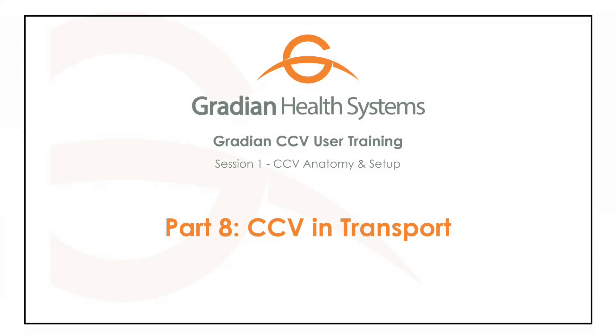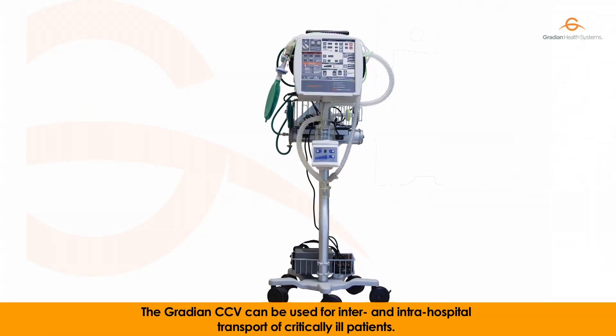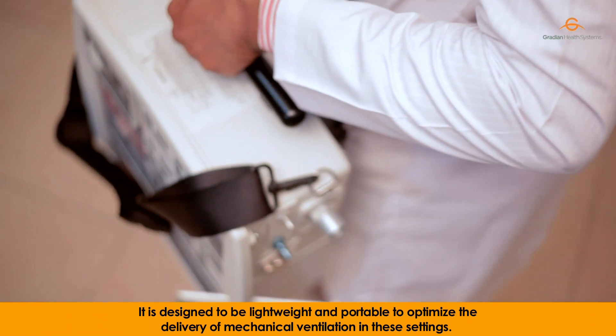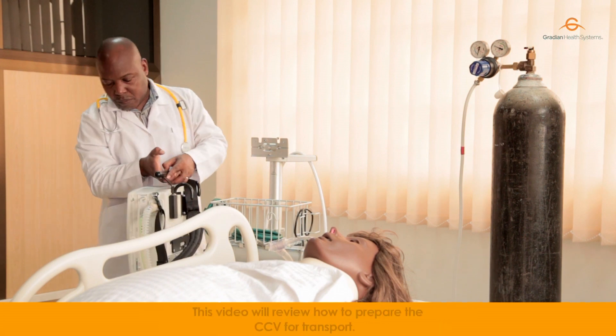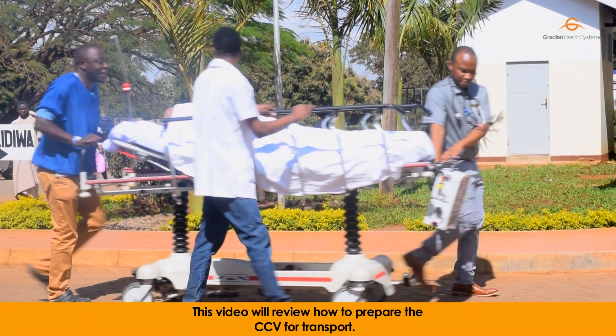The Gradient CCV can be used for inter- and intra-hospital transport of critically ill patients. It is designed to be lightweight and portable to optimize the delivery of mechanical ventilation in these settings. This video will review how to prepare the CCV for transport.